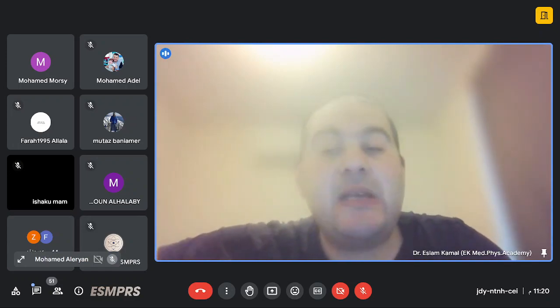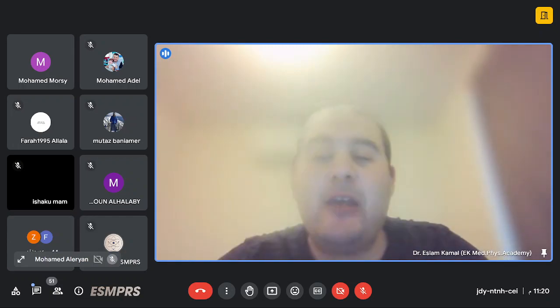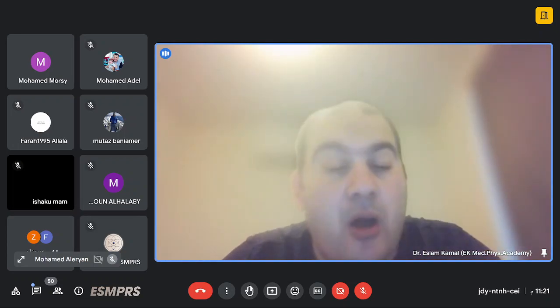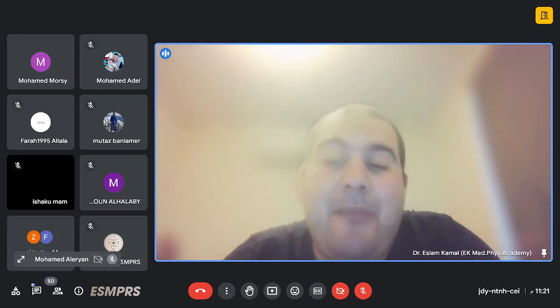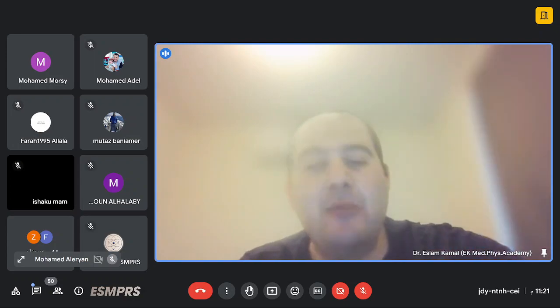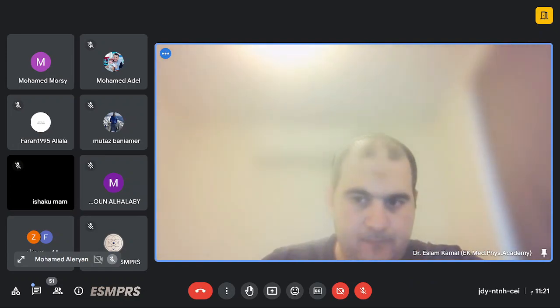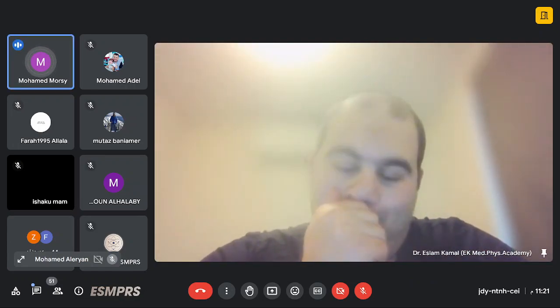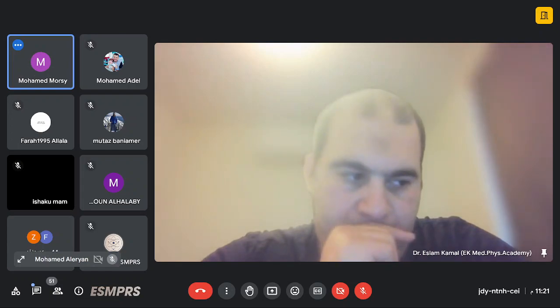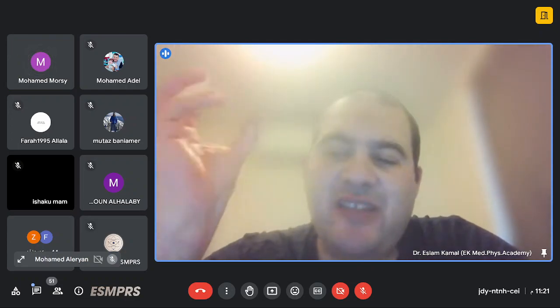فانت كل سيكونس بتعمله انت بتاخد منه معلومه تشخيصيه او تزود بيه قدرتك او التباين اللي موجود بين الانسجه المختلفه، سواء كان انك تفرق ما بين نسيج واخر، بين باثولوجي واخر. فما فيش سيكونس بيتعمل الا وله هدف معين في البدايه، هدف تشخيصي عشان يحل مشكله معينه ويبتدي يحصل تطوير عليه او يكتشفوا له ابلكيشن جديد. بس يعني اجابتك كمسمى سبين ايكو، يبقى احنا كده بنتعامل مع الايكو اللي بيحصل له ريكفري، وعشان كده سميناه. تمام. عشان كده بتدي ال 180 ديجري بالس عشان تعمل ريفوكسنج للبالس بتاعك.